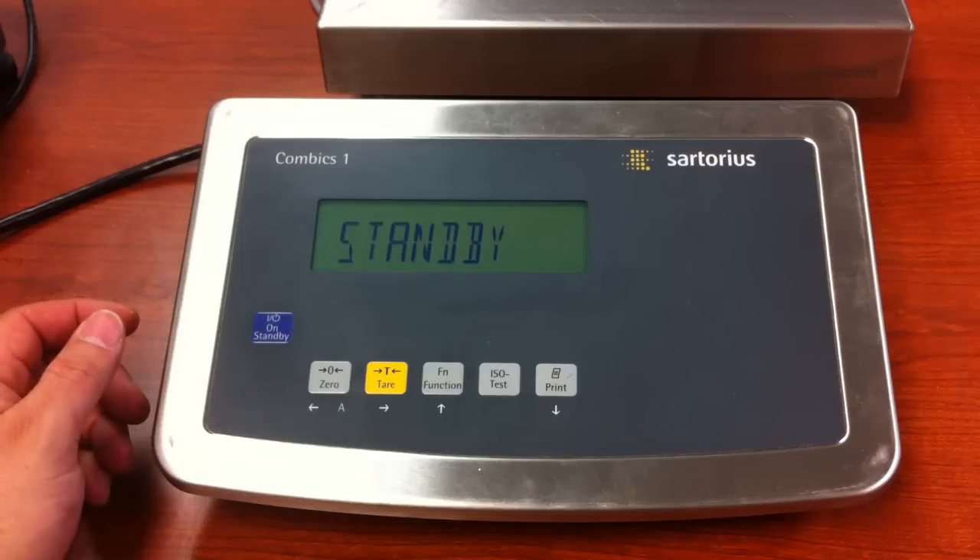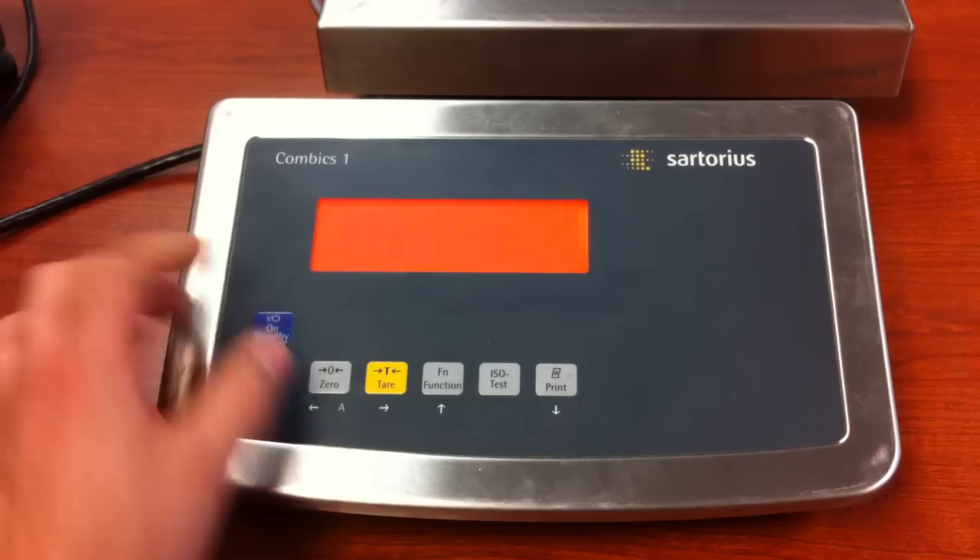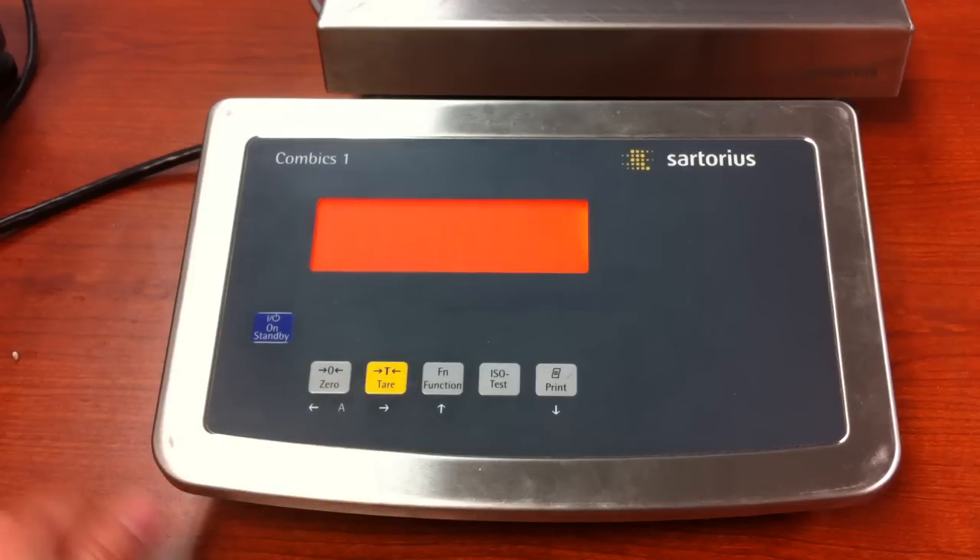Turn the unit off, or start with it off, turn it on, and press and release the tear key during the segment check.